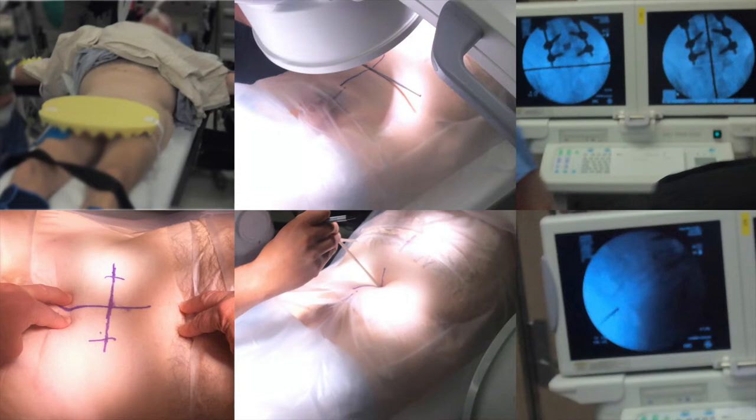Positioning a patient for an ALIF: the patient is placed supine on a radiolucent flat top table that we can fluoro through, with arms out to the sides. The patient is then placed into Trendelenburg to allow the abdominal contents to slide cranially, and the abdomen is then prepped and draped in usual fashion.